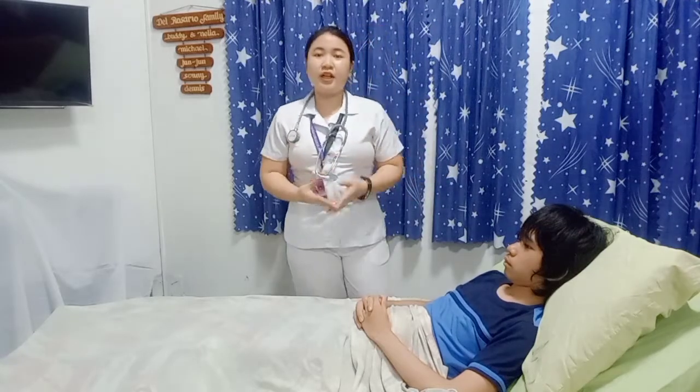Now that I'm done palpating my patient's carotid artery, I will now auscultate it. Instruct the patient to turn his head slightly away from the side being examined. This facilitates placement of the stethoscope. Then ask the patient to hold his breath while you are auscultating the carotid artery so that breath sounds do not conceal any vascular sounds. Then, listen for the presence of a bruit, the blowing or swishing sound that is caused by turbulent blood flow through a narrowed vessel. If you hear a bruit, gently palpate the artery to determine the presence of a thrill.